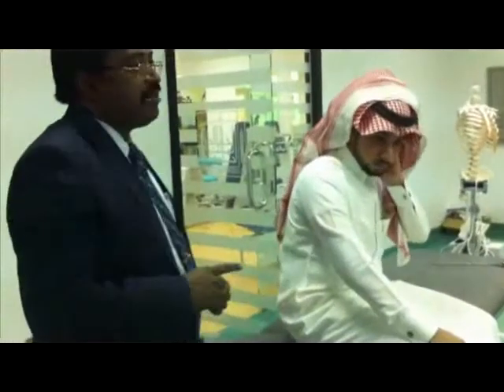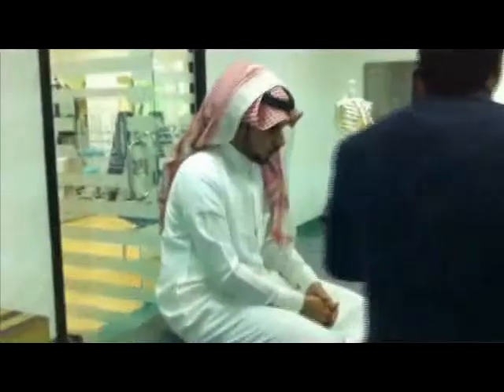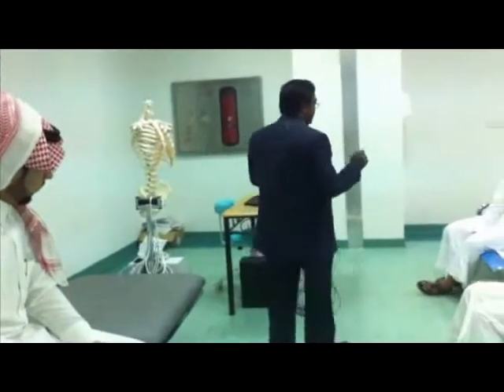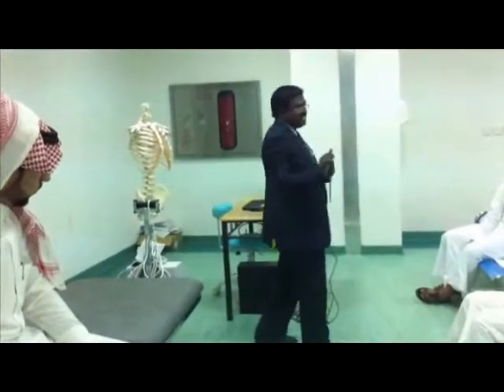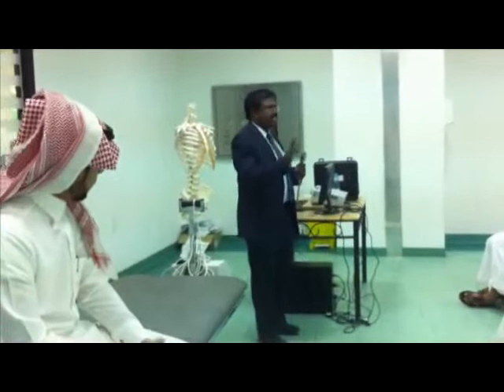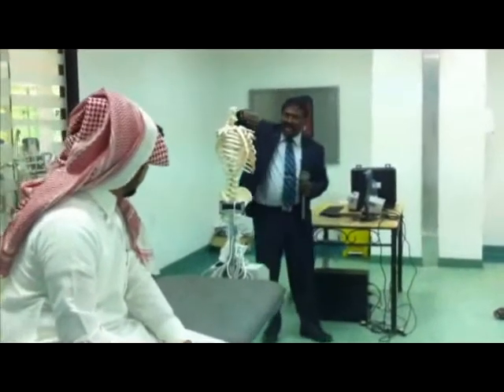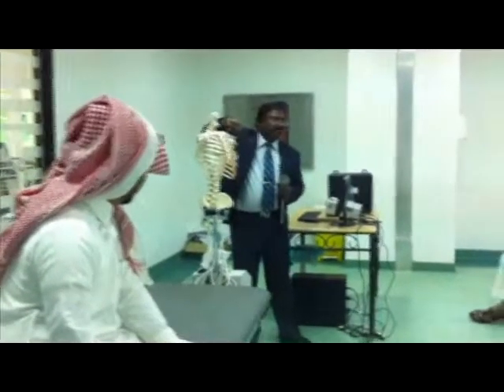There is something called a fulcrum — where I should put the fulcrum, the center part of the goniometer. If you move this fulcrum, the range of motion will go away. The fulcrum for shoulder flexion, extension, abduction, and adduction is the same — only one fulcrum. That is called the acromial process.